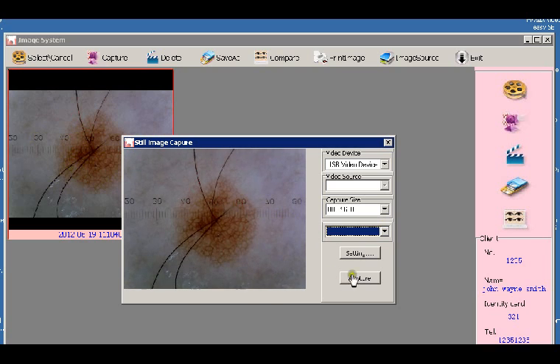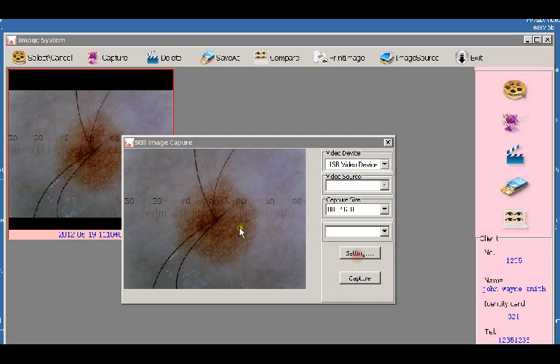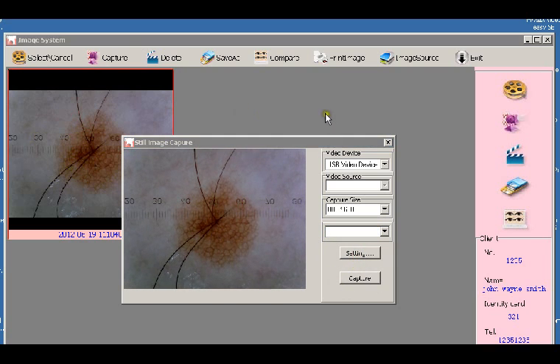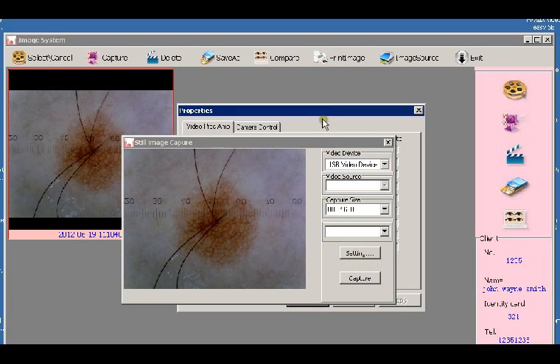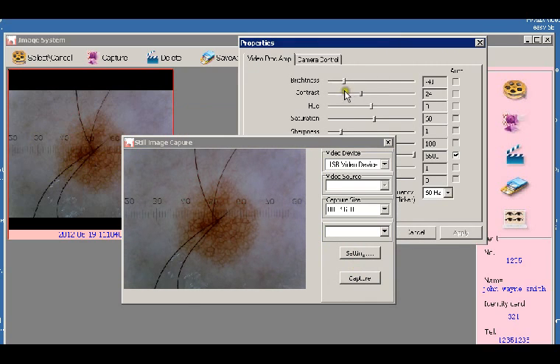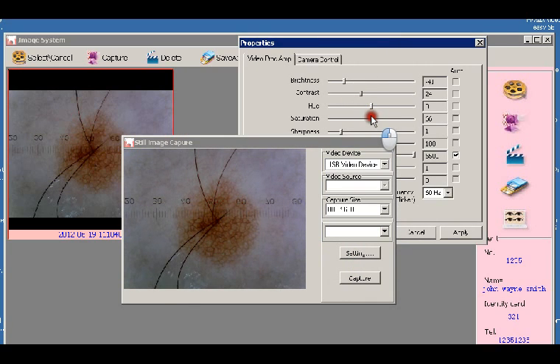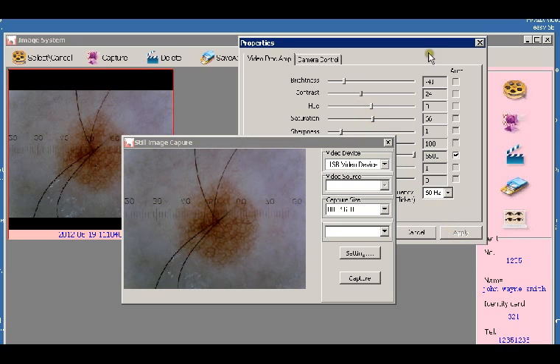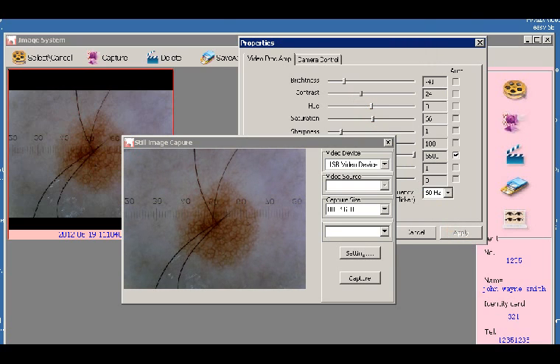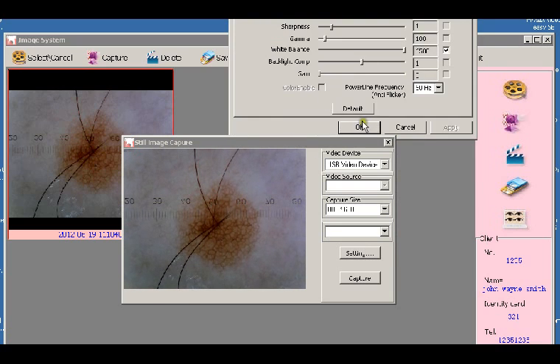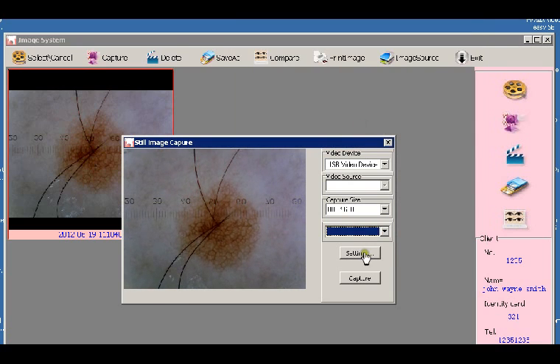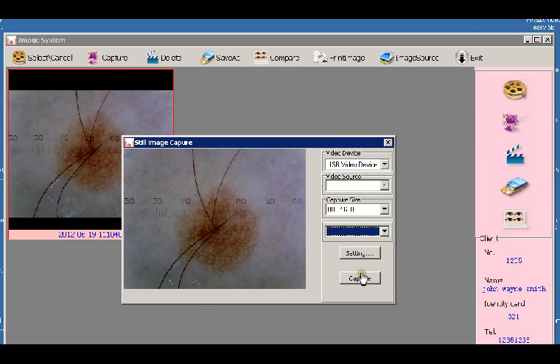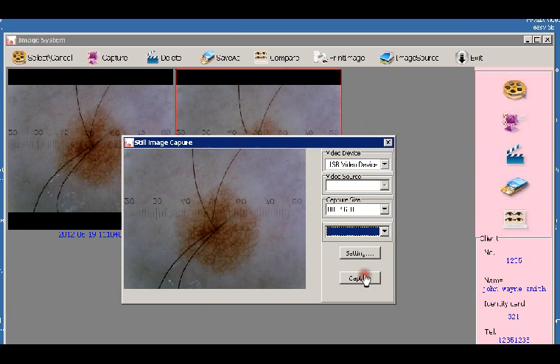You can also change the settings of this. I'm going to bring this in here to show you that you can change the brightness, the saturation. So I'm just going to bring the saturation down a bit and apply it. Okay. And capture that same image again.